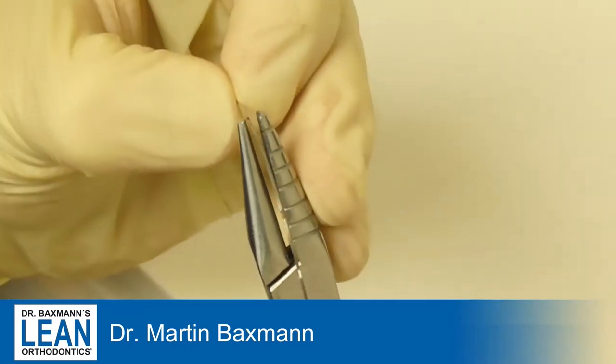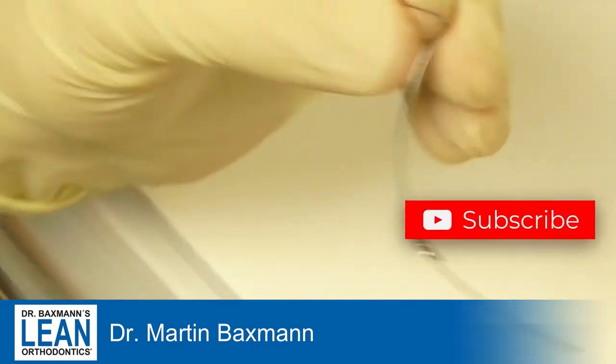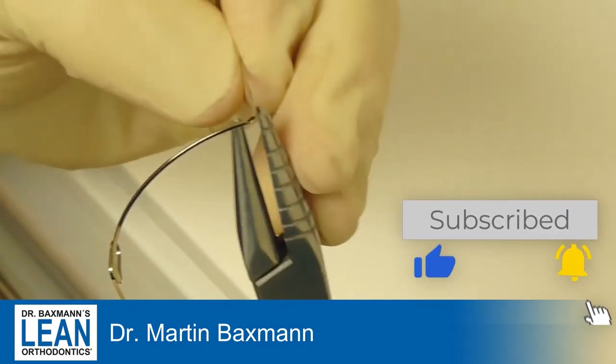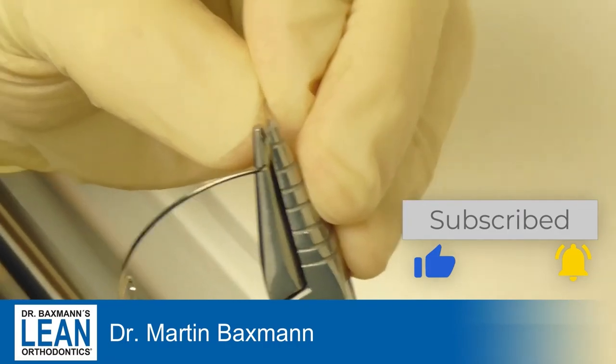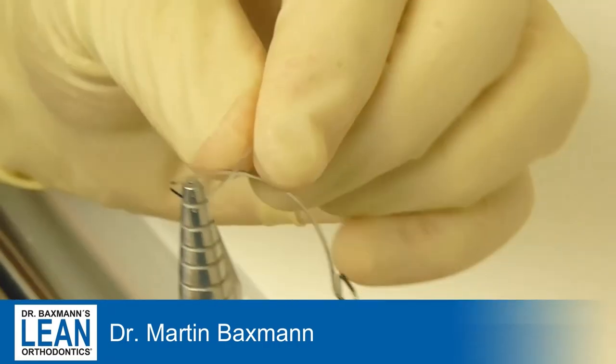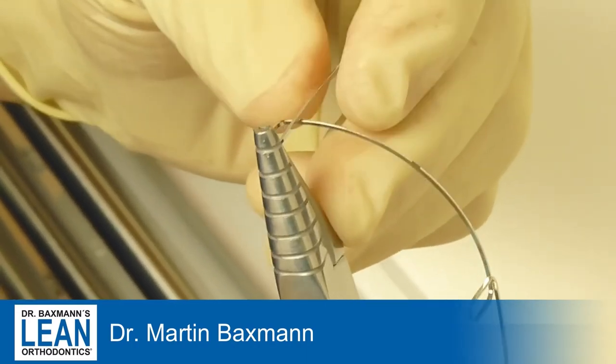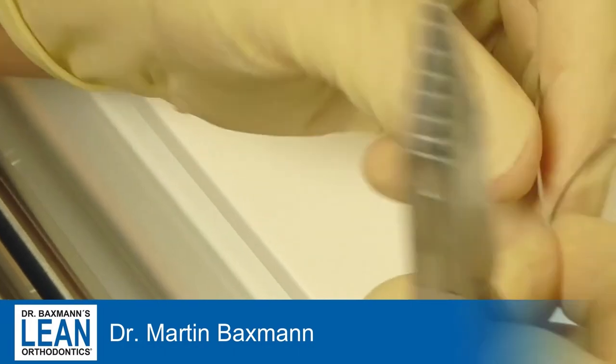You can see here how I mark the wire, because I'm going to do that on both sides — the right and the left. It's crucial to do that symmetrically when you have a symmetrical case. If you have an asymmetry, you can obviously activate both sides differently and use different force systems on either side.